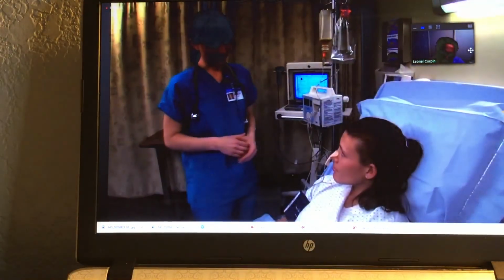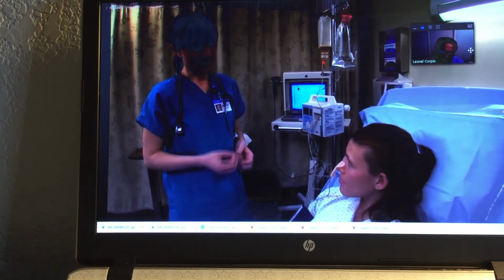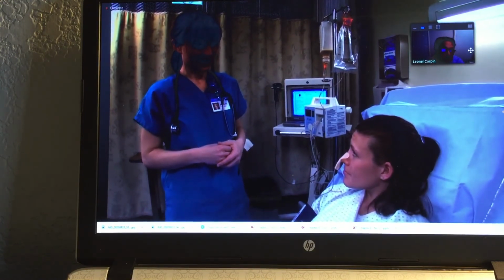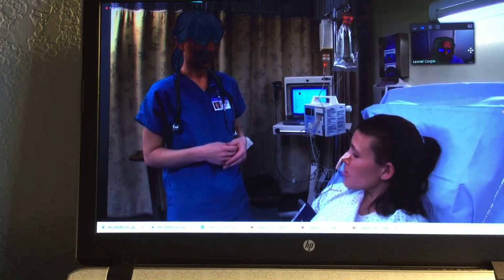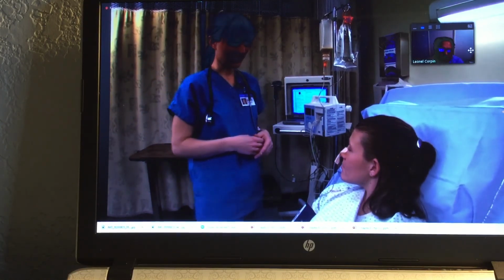When you complete the feeding, document the client's response, especially any adverse effects related to the feeding or the infusion. Anytime the tubing is disconnected, flush the tubing with 30 milliliters of water so that the tube does not become clogged. You can do this manually or program the pump to flush the tubing when feeding is complete.